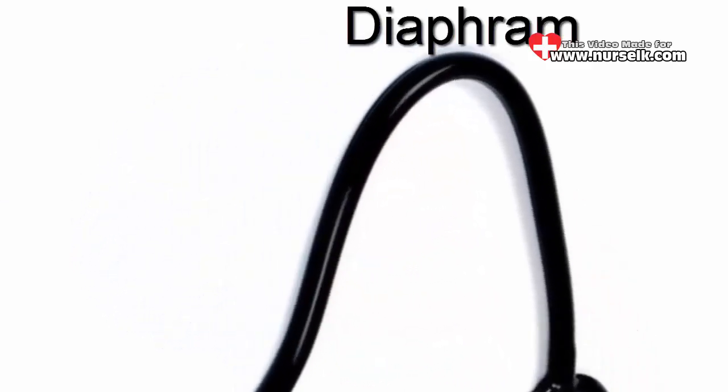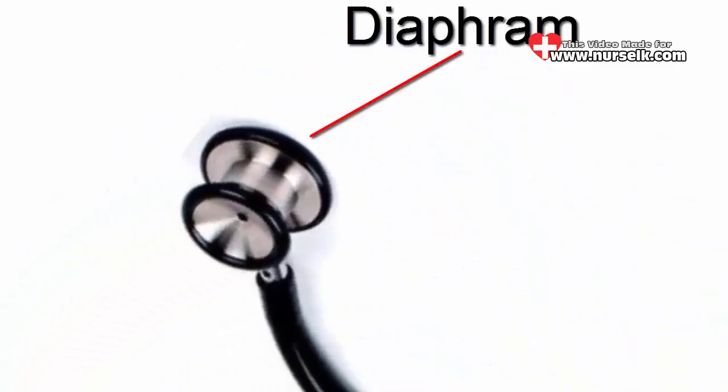Diaphragm. The diaphragm is the large circular end of the chest piece. This side of device allows medical professionals to listen to a wider area of the patient's body and picks up higher frequency sounds than the bell half of the chest piece.